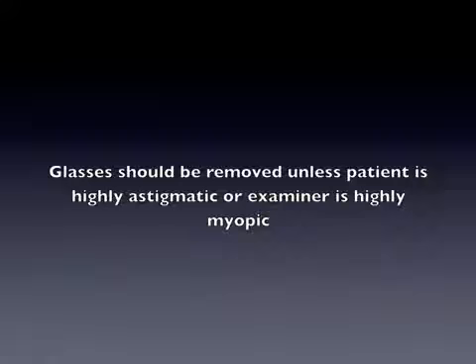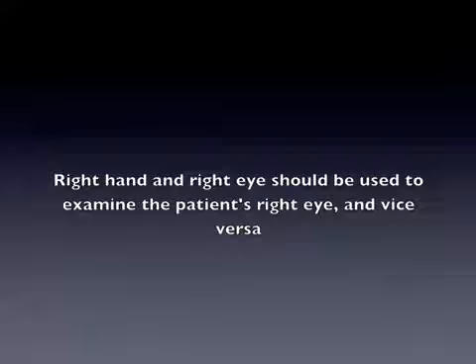This allows the ophthalmoscope to be held as close as possible to the observer's eye. When examining the patient's right eye, the observer should hold the ophthalmoscope in his right hand, with the right forefinger controlling the dial, and vice versa for when examining the left eye.